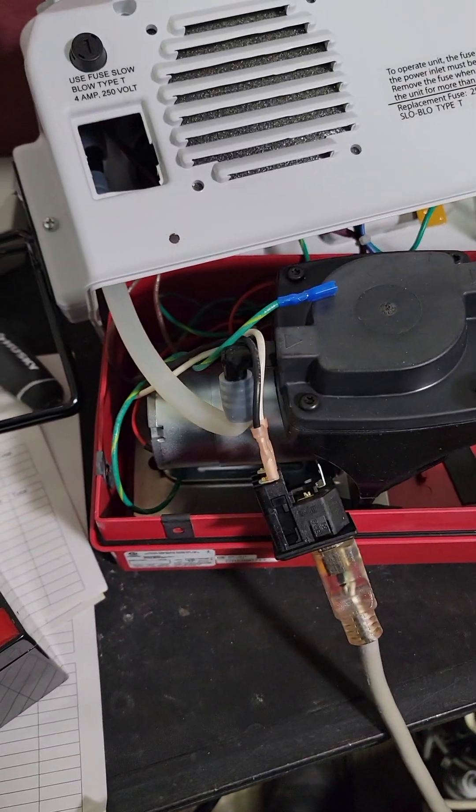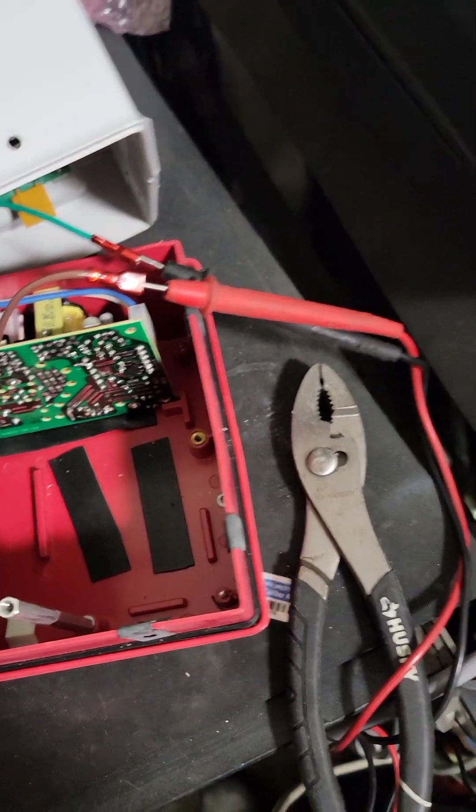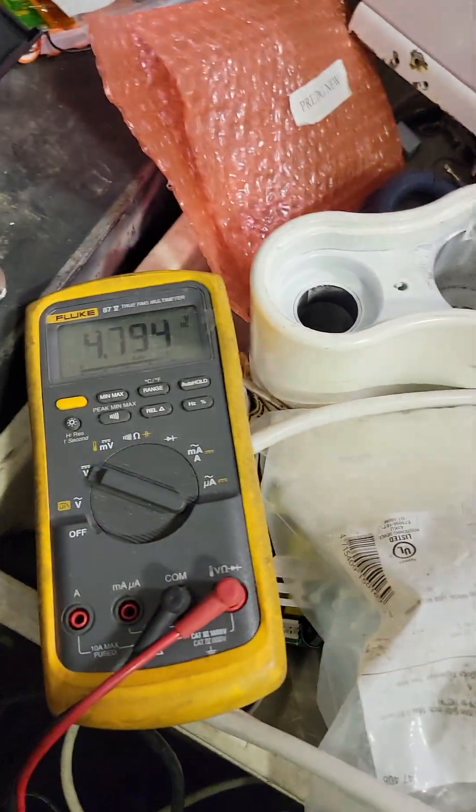This is one of those units that runs off battery, so AC charges it. You gotta plug your battery back in — it has to have the load on there for it to be getting an accurate reading.